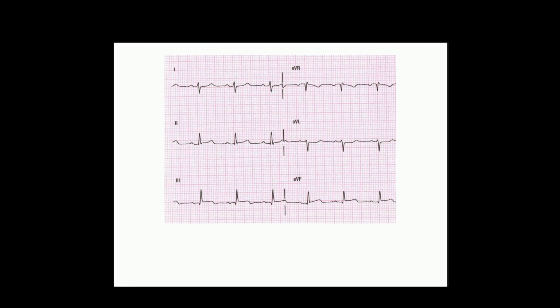Here's another one. So, Kyle, where's the STEMI here? Where are the reciprocal changes? STEMI in the inferior leads 2 and 3, and reciprocal changes in 1 and AVL.